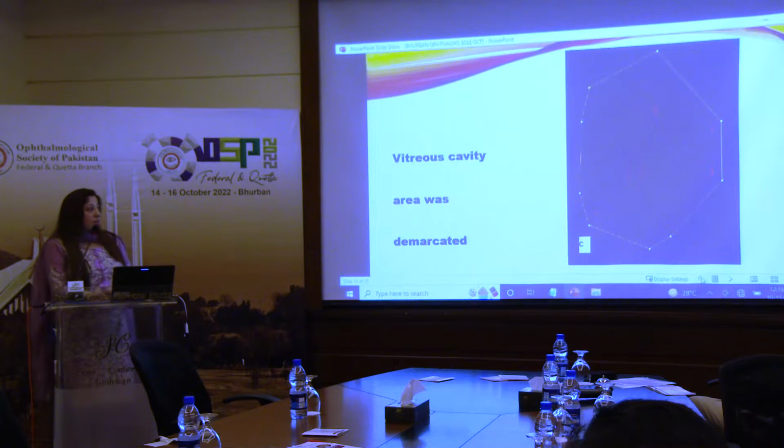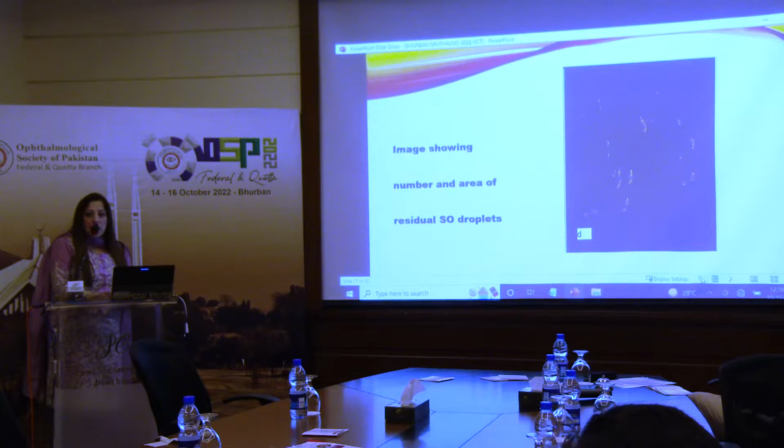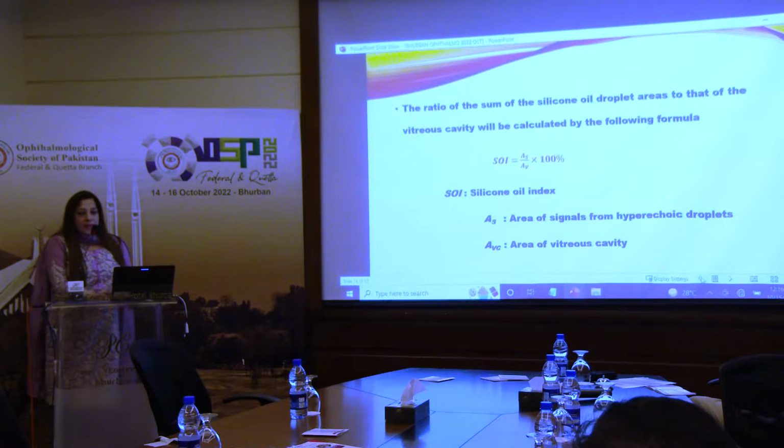Now, the vitreous cavity area was demarcated. This software gives us the exact number of residual oil droplets and the area of each droplet. After this, the silicone oil index was calculated, which was the sum of silicone oil droplet areas over the area of the vitreous cavity.